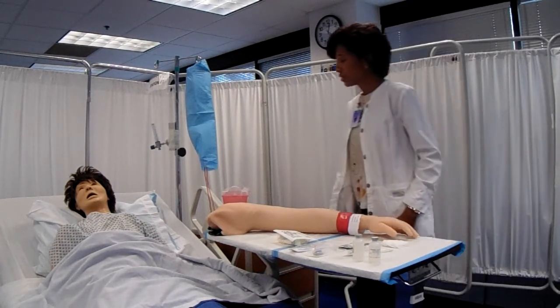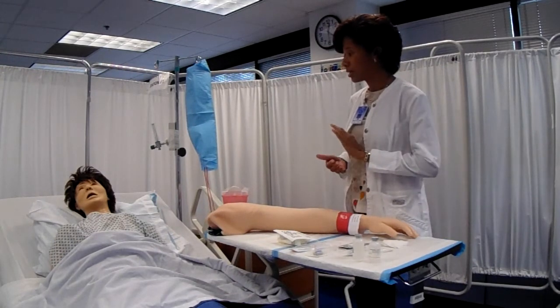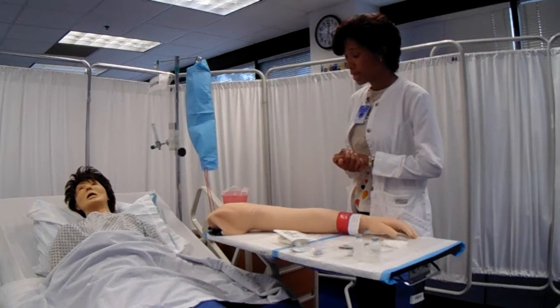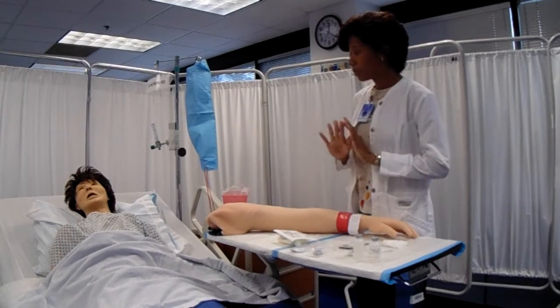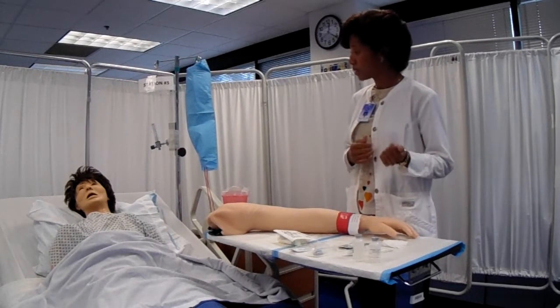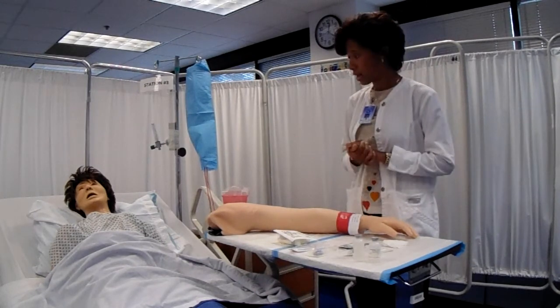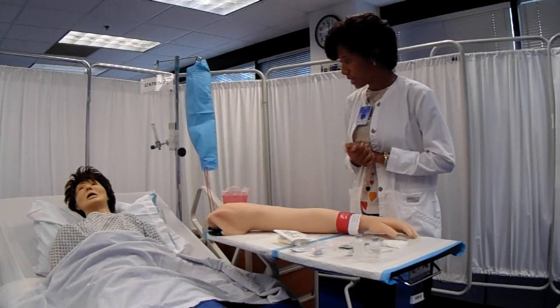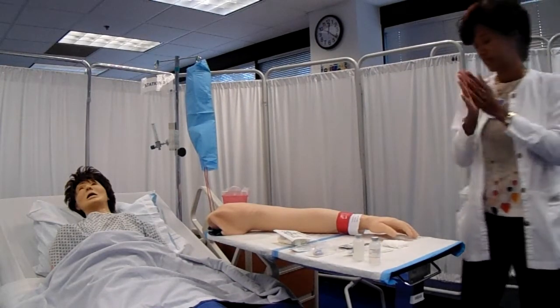Hi, good morning. My name is Nurse Marks, and this morning I'll be inserting an IV and administering some IV medication that the doctor has ordered. But before I even begin, let me go ahead and perform some hand hygiene and put some gloves on, and then we can verify that I'm with the right patient. I already washed my hands outside.